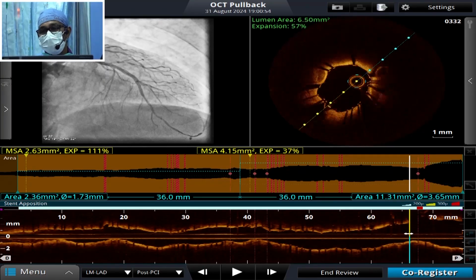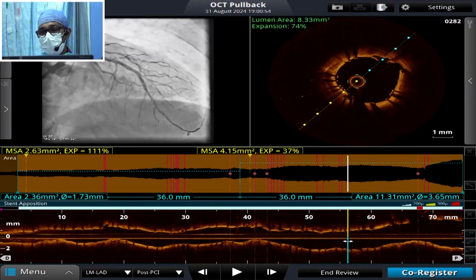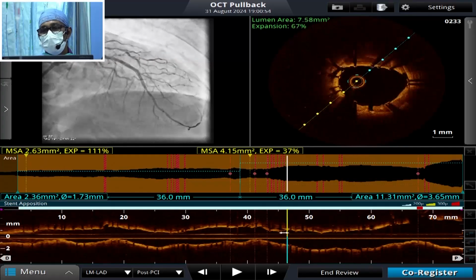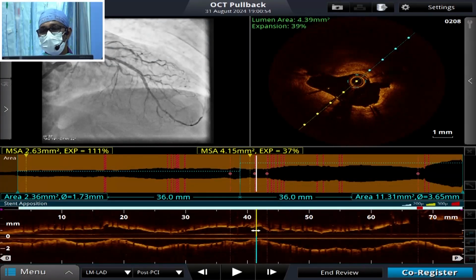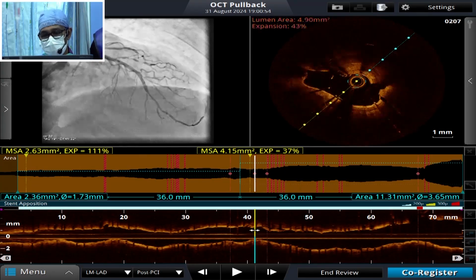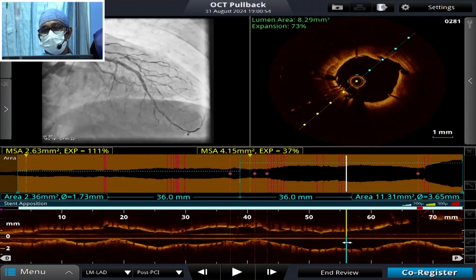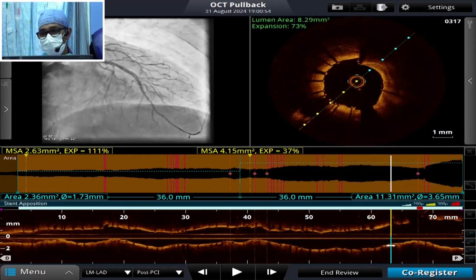That area, the left LAD stent, we have gone up to 16 atmospheres or so. The LAD looks good, 3. It is almost 5 in that area. Almost 5 where we have the overlap of stents. And as we come proximally, it is 7, 8 or so.